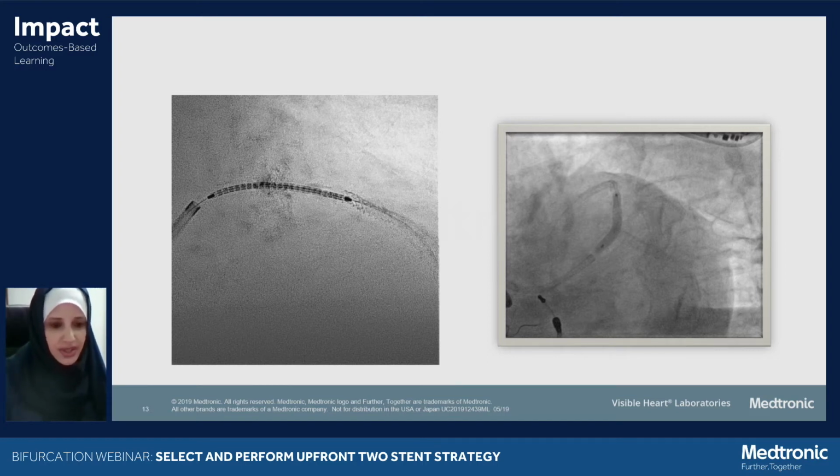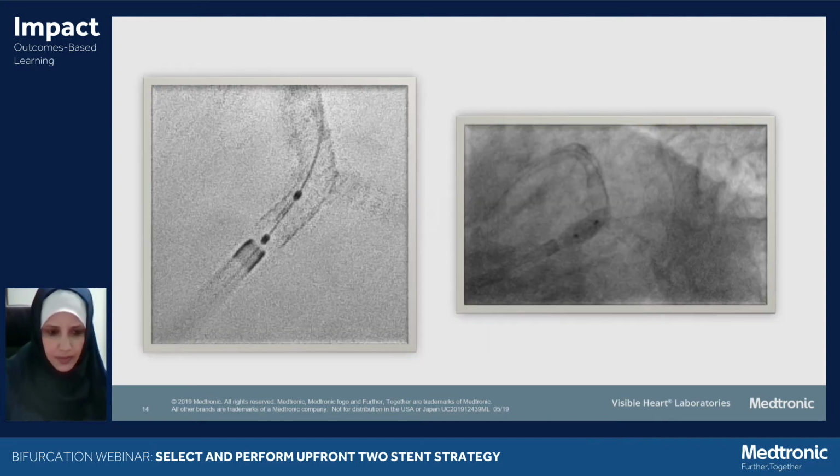We use ClearStent or StentBoost over here. We want to make sure distally we're overlapped, and then we come back proximally. We want to make sure we're covering the entire segment of disease in the LAD back to the left main. And on your right hand, you can see the crushed stent in the circumflex and the still frame over there. So at this point, again, we use ClearStent to help us position our POT balloon.